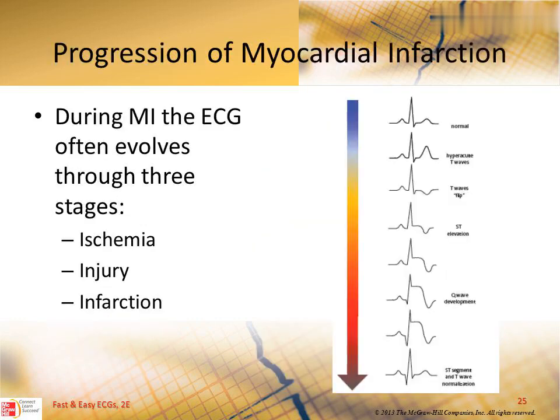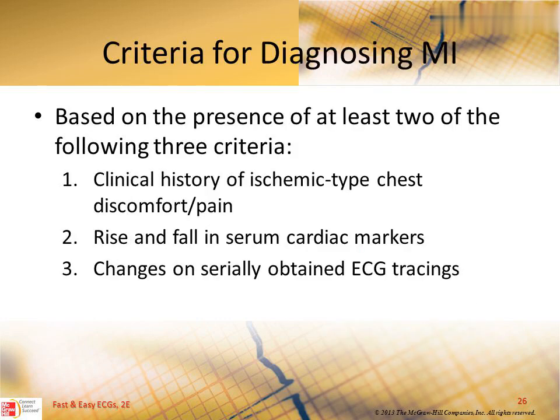Progression of myocardial infarction. During MI, the ECG often evolves through 3 stages: ischemia, injury, infarction. Criteria for diagnosing MI.